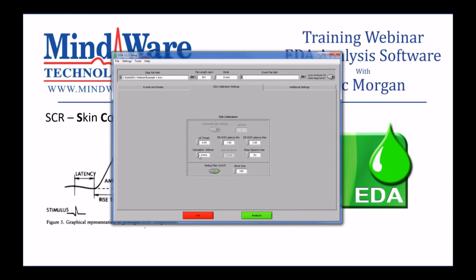The next row, we see the calculation method. This allows you to break up your segment into many smaller segments to get statistics about them, even though you're looking at it in a larger context. I'm going to leave it as an entire, but if anyone has any questions, or if we have time later in this webinar, we'll go back and we'll experiment with this a little bit, and I can show you what it does.